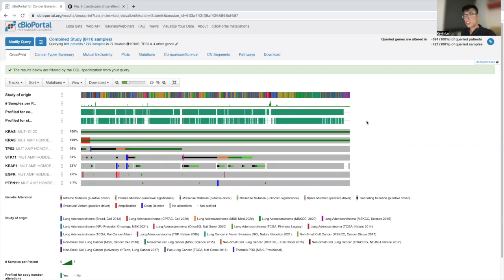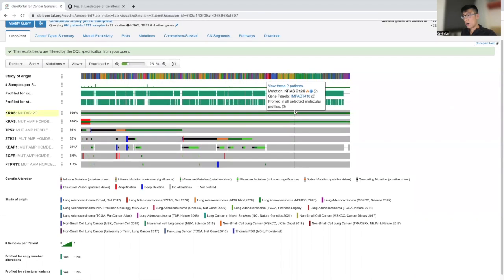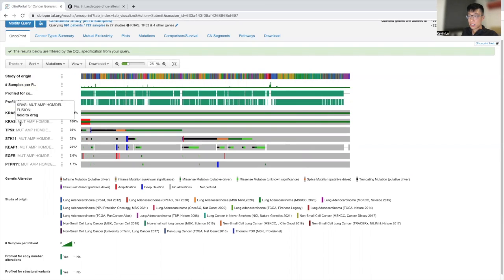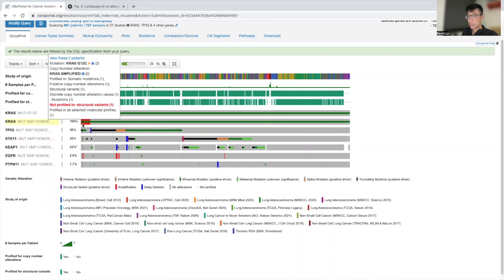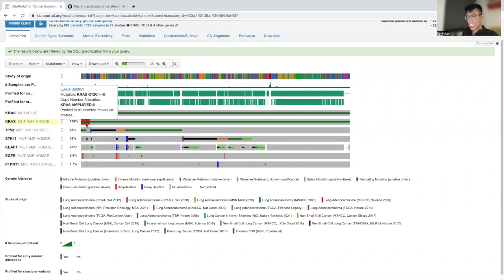So now you can see, instead of that, I believe it was 11% or so, now we have 100%. And so all these patients that we're taking a look at right now have the KRAS-G12C mutation. In addition, we looked at patients with KRAS alteration. And as you can see, all these patients should have a KRAS alterations caused by KRAS-G12C. In addition, we see a subset of patients that have a KRAS amplification.